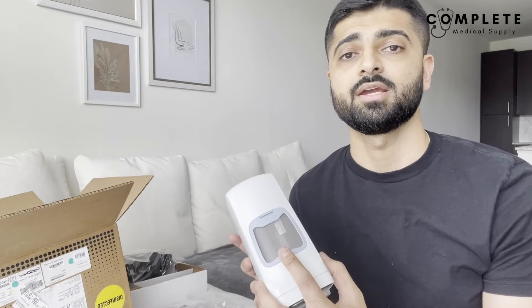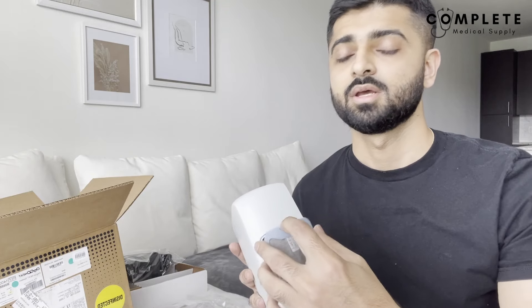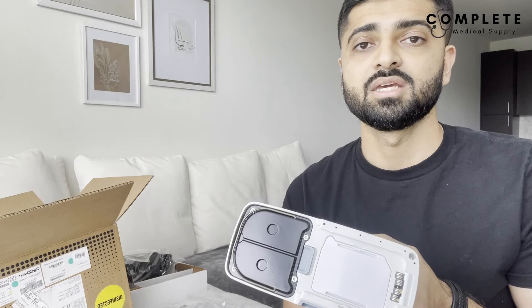The portable unit has a filter that opens easily — similar to the home concentrator, hand wash it and make sure it's completely dry before putting it back in. The last thing that needs to be changed every 18 to 24 months is the sieve beds, which are the internal filters of the machine. These expire over time and the machine will alert you when they need to be changed — at that point, call the company you got it from to find out the cost of replacement.